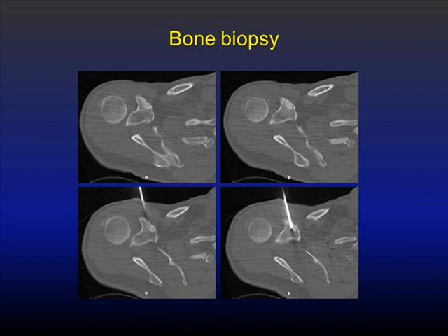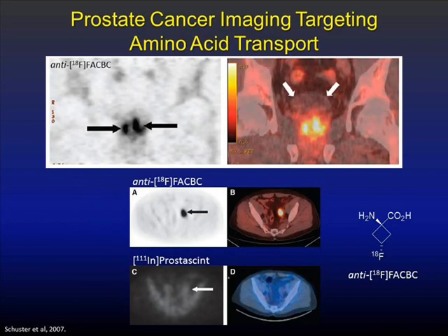And unfortunately for this gentleman, this was recurrent cancer, but it's important to know rather than just watch someone when perhaps they could benefit from more aggressive therapy rather than just watching their PSA levels. There are some new agents for prostate cancer that are in clinical trials. I don't know if or when they'll become clinically available, but there's great interest.